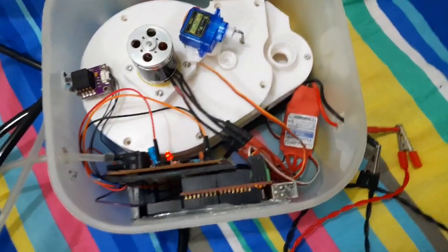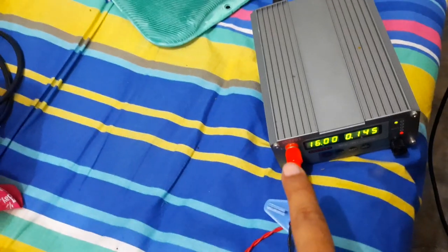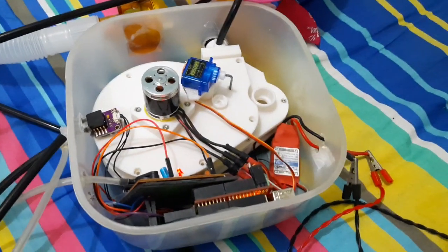So don't worry, I will actually release all the files. This is the bench power supply we have been using right now. So let's start the ventilator and see the graph.